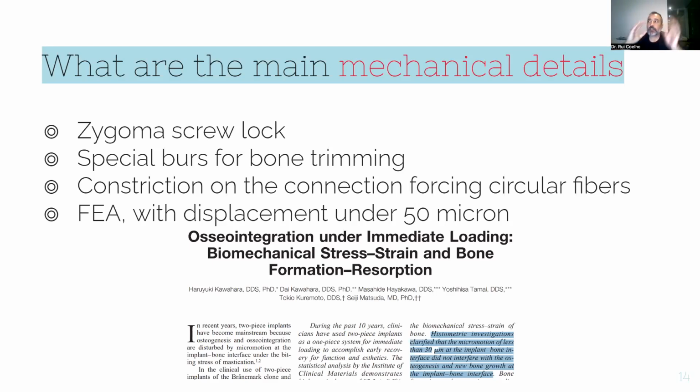This is what is going to change from subperiosteal implants. You know that with subperiosteal implants, you accept that it can move a little bit. You even accept that on zygoma implants, and you let it stay, and you call it a success.